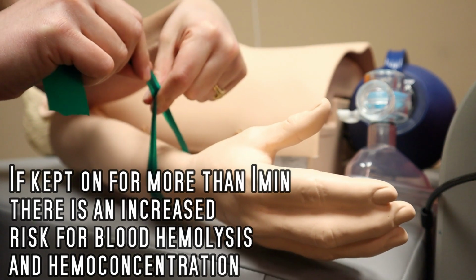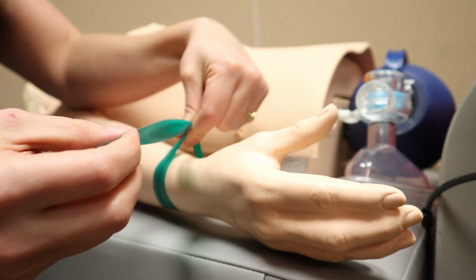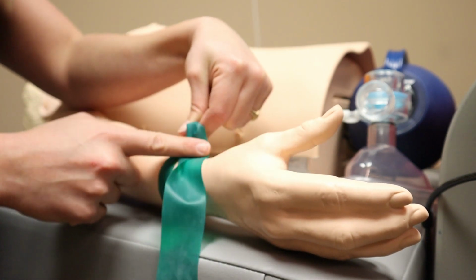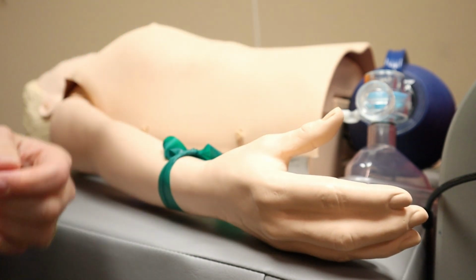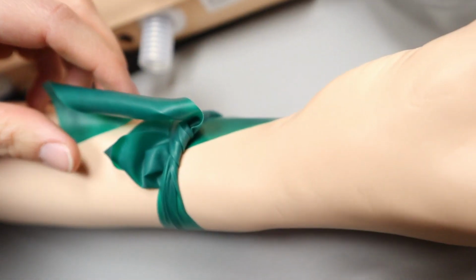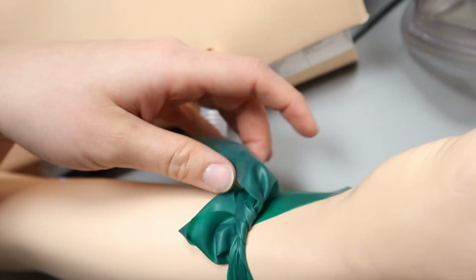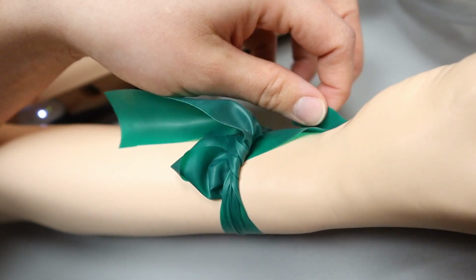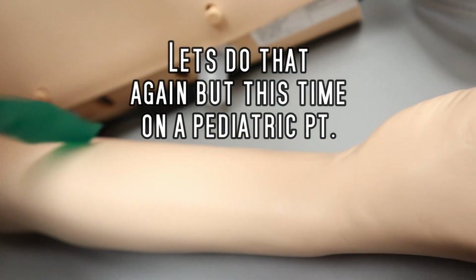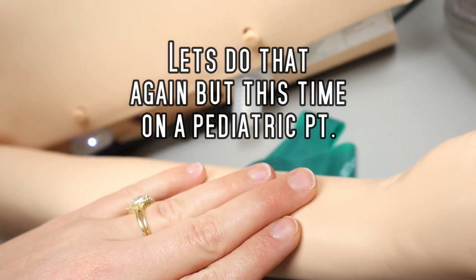Then I'm going to hold them and pinch between two fingers, nice and tight, and just drop this portion. Now this big portion that you dropped, all you have to do is take your finger and tuck it under. And that is it. That's all you want to do. And now you can see you have these two little pigtails here. And when you go to take this tourniquet off, once you get your flashback in your IV chamber, all you have to do is take that piece that you tucked under and pull it, and it simply just comes right off, and you're not pulling the patient's hair, and you're not really hurting their skin either.